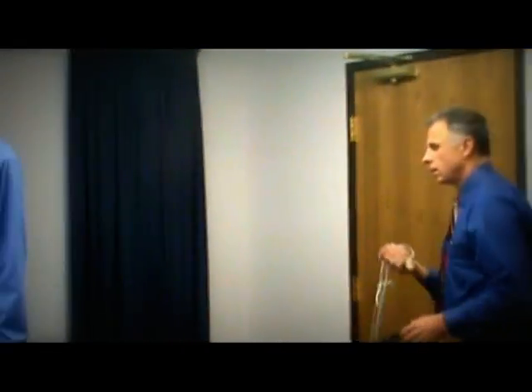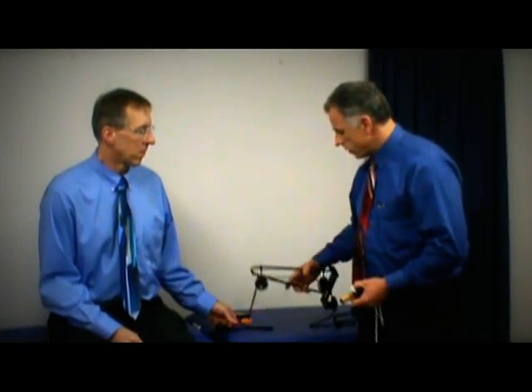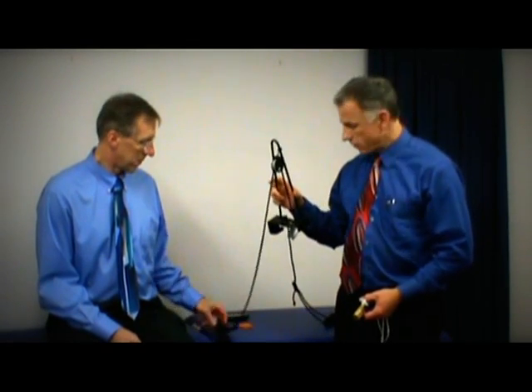So, all right. Anything else you want to say, Brad? No, homemade pulleys are great, and like I said, typically if you got someone handy, you're going to make a better one than you're going to buy for $30, probably for like $5 or $6. Yeah, or $8. Excellent. The pulley is the key. Yeah. Having a good pulley. So, all right. Thanks a lot.